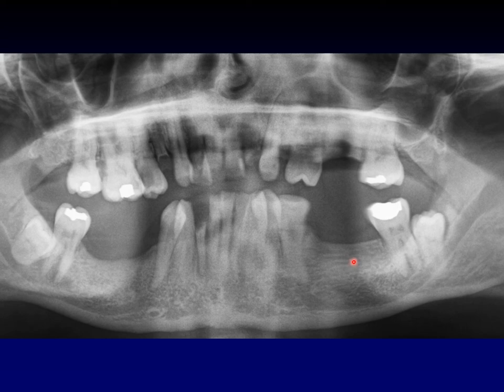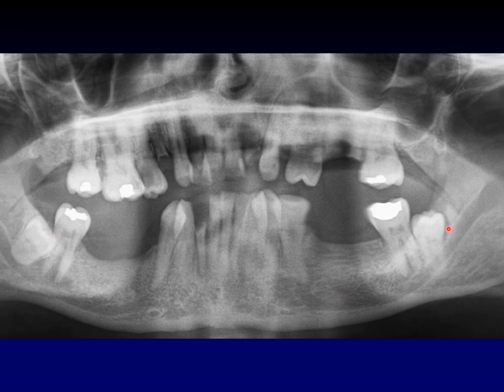This is also a good image to talk about the difference between an unerupted and an impacted molar tooth. If a molar tooth — usually the wisdom tooth — is trying to erupt in the teenage years and runs into something blocking it, that's an impacted molar tooth. But sometimes the tooth just decides it's not going to erupt even though there's nothing in the way. We call this an unerupted molar tooth. So unerupted on this side and impacted on that side.